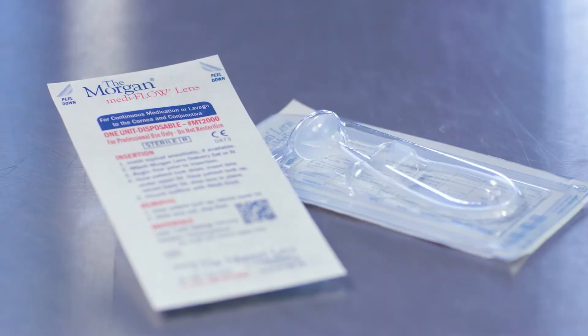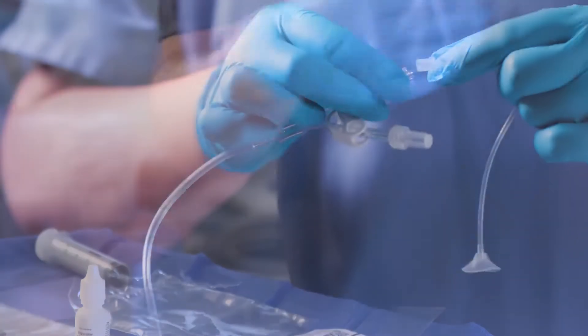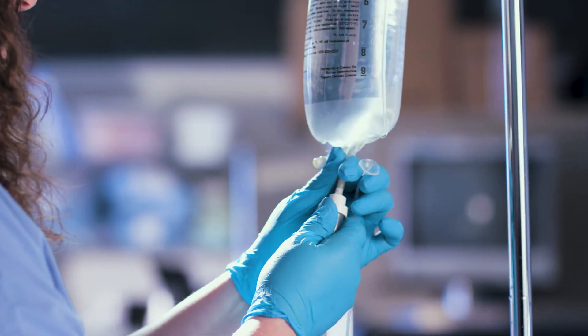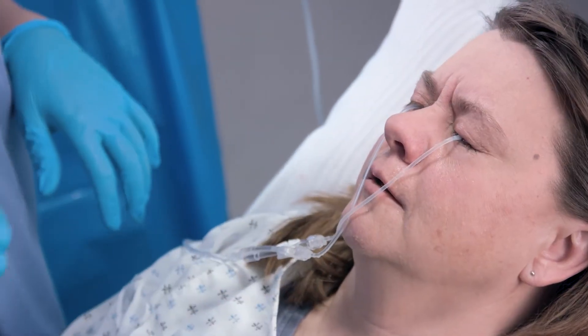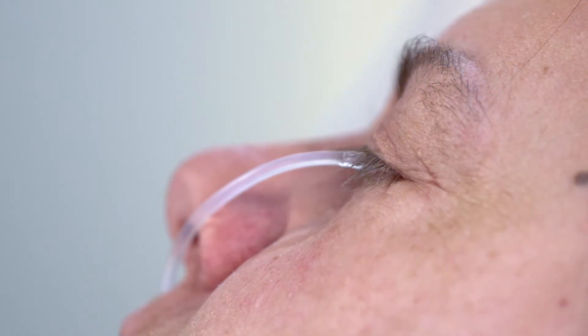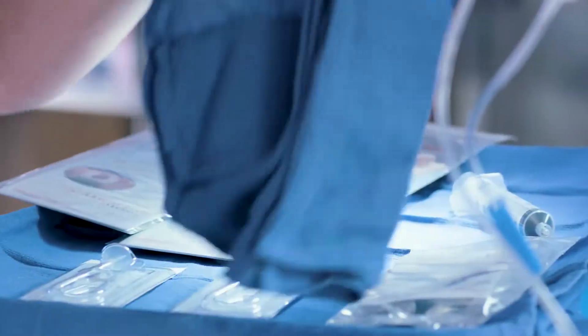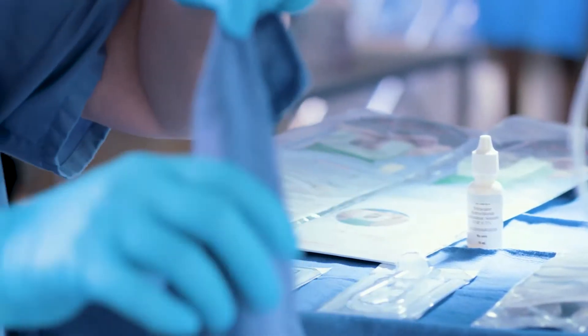Peel open the sterile packaging and attach the Morgan lens to the Morgan lens delivery set and a solution of choice. The delivery set allows you to easily irrigate both eyes simultaneously or just one eye using the pinch clamp. You may also use a standard IV set or attach a syringe if you need a smaller, more controlled application.